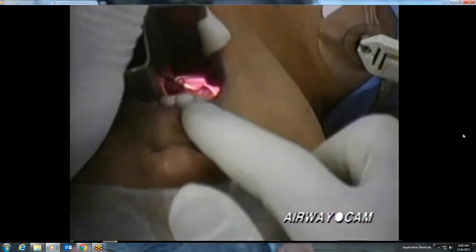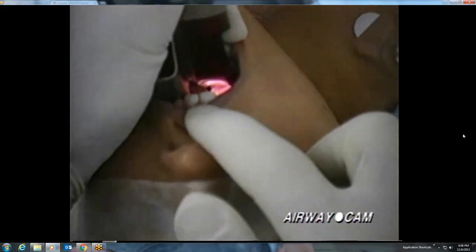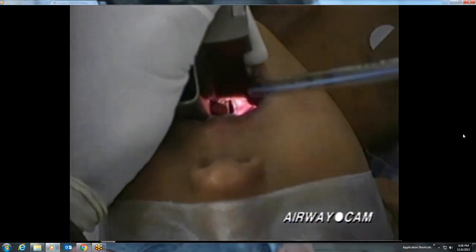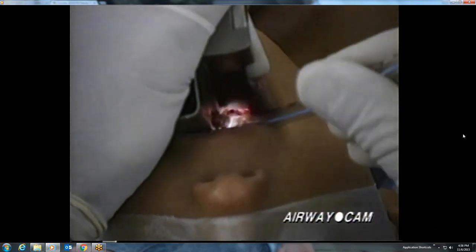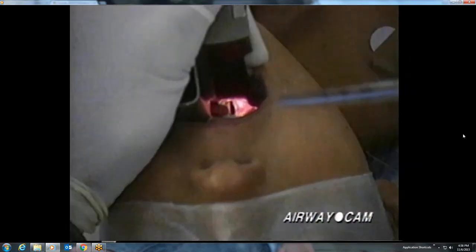This next case involves laryngoscopy on a 5-year-old child with a Macintosh No. 2 blade. A very sharp view of the vocal cords is achieved. A cuffless endotracheal tube is inserted down the right side and into the larynx. Reviewing this laryngeal view one more time, notice the large vestibular fold adjacent to the vocal cord on the right. Also notice that the anterior commissure of the vocal cords is well seen in this patient.